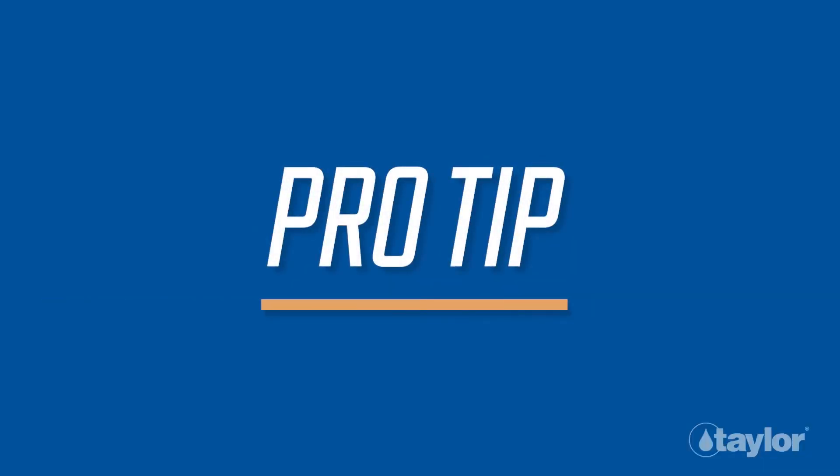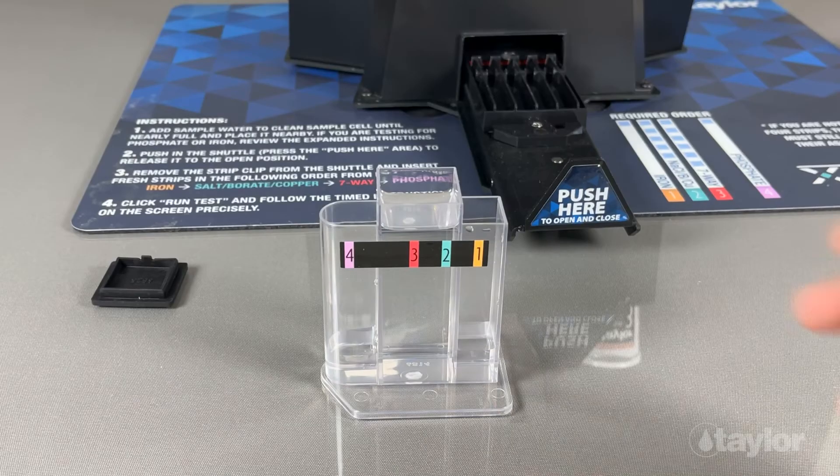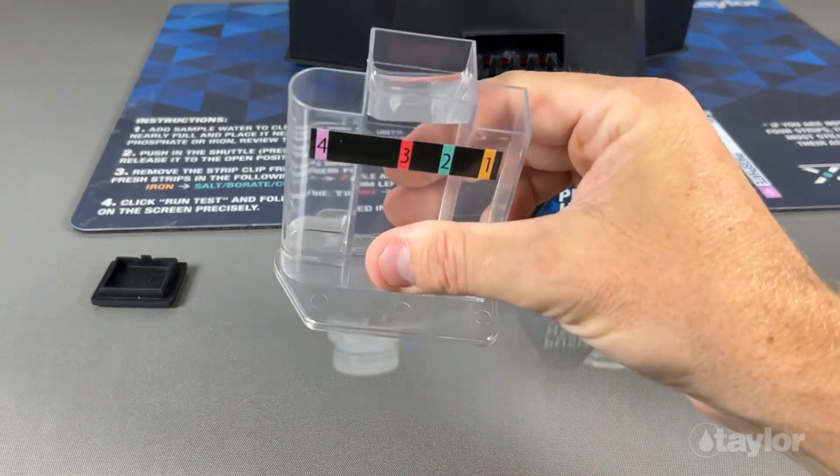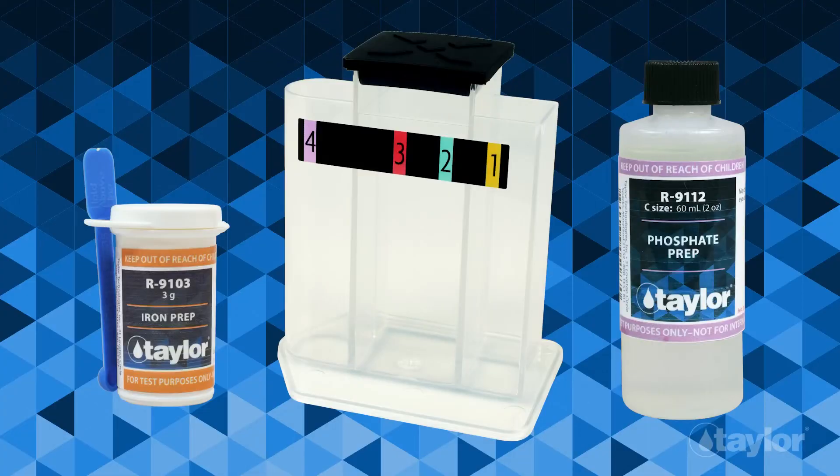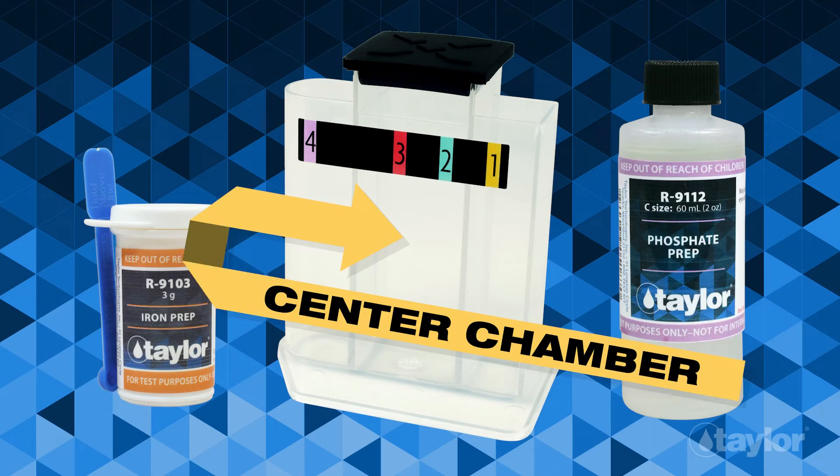Pro tip: for best results, pour used sample water out of the vial by holding the vial horizontally versus vertically. The iron and phosphate test prep reagents can cause interference if they enter and contaminate the center chamber.